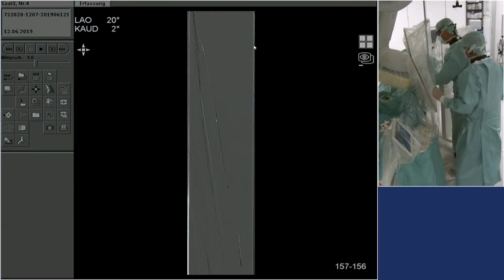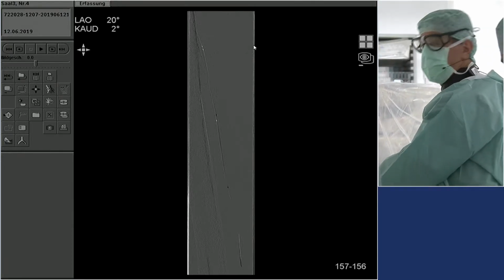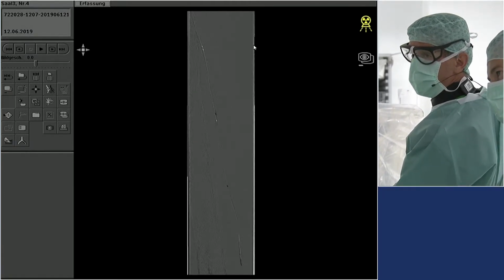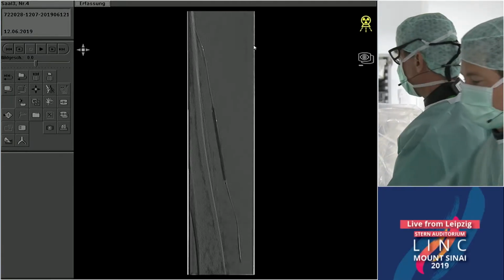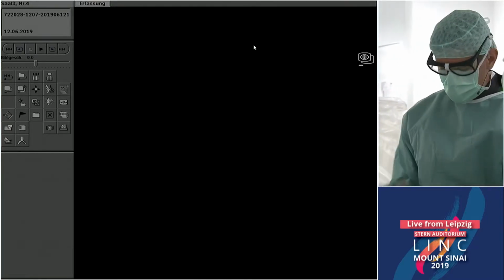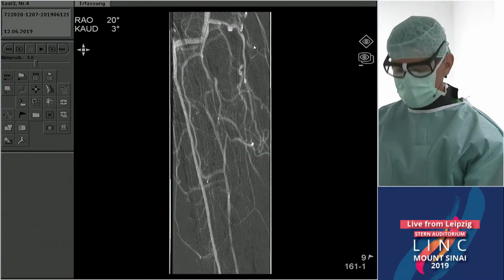Yes, thank you. We are still working, of course, on that lesion. Just a moment. I need to inflate the DCB, this Stellarex, 2.5 by 80. Yeah, a little. 380. He feels it. Yeah. We have quite some spasm currently. Just a moment.